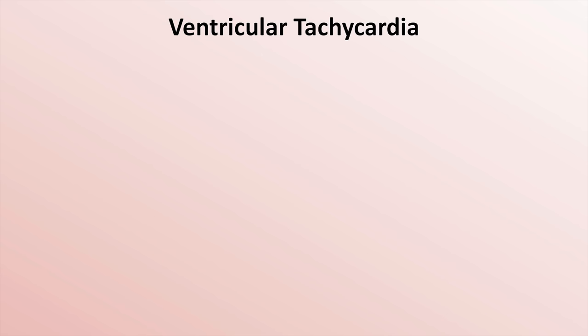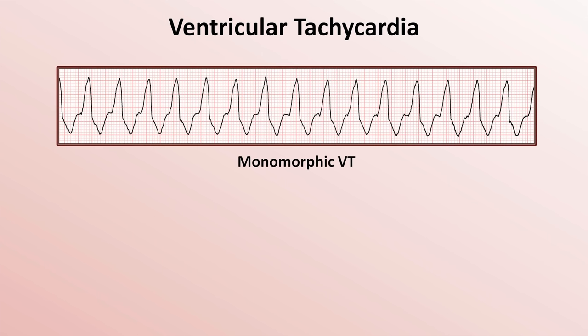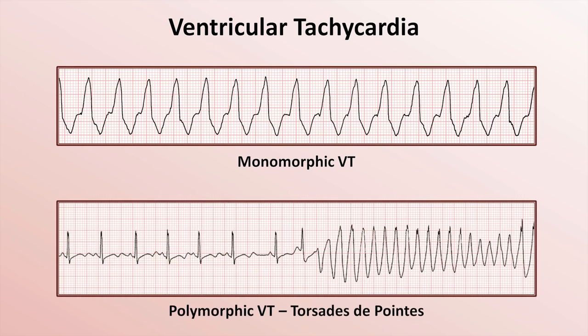Here's an example of monomorphic VT. The small bump on the downslope of the second T-wave is suspicious for a dissociated P-wave — evidence of AV dissociation. Here is a classic example of the much rarer polymorphic VT, specifically torsade de pointes, which is almost universally caused by a prolonged QT interval.